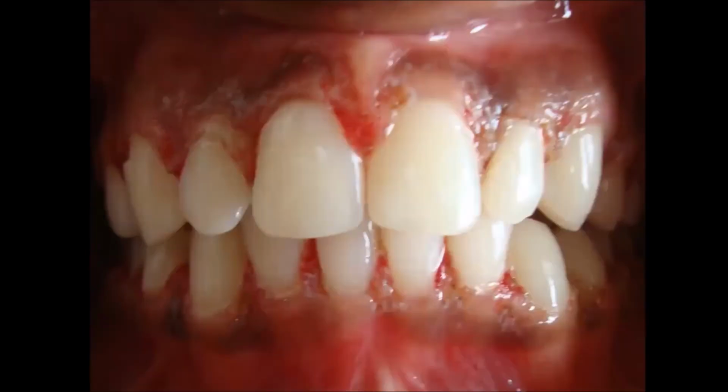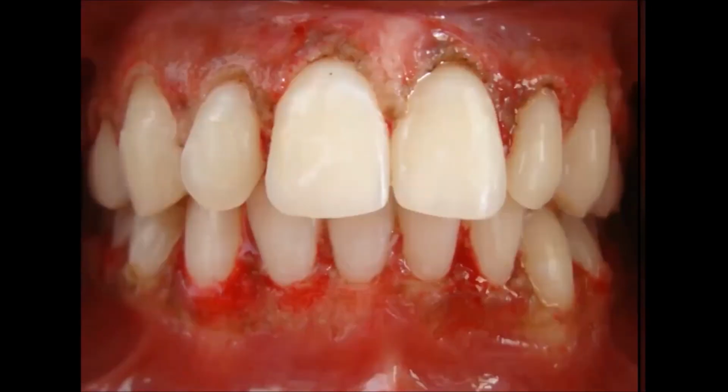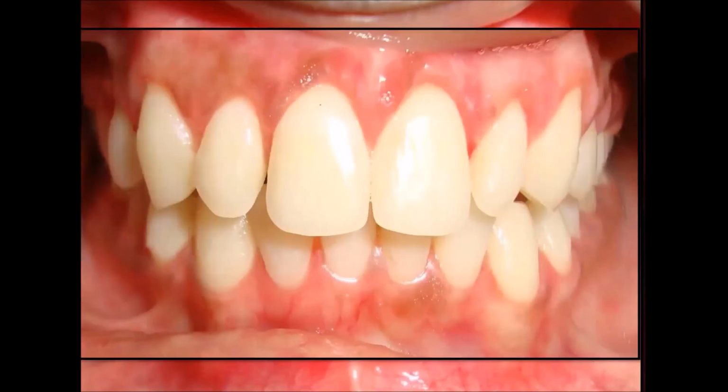We also did a procedure called crown lengthening and gingivoplasty. This is how we completed the case on day 1. And you can see 24 hours later, you remember I told you the white and yellowish band-aid, or the laser band-aid, that is how you would see it. And this is 15 days later.